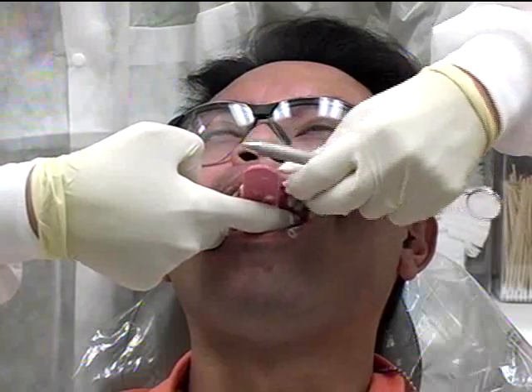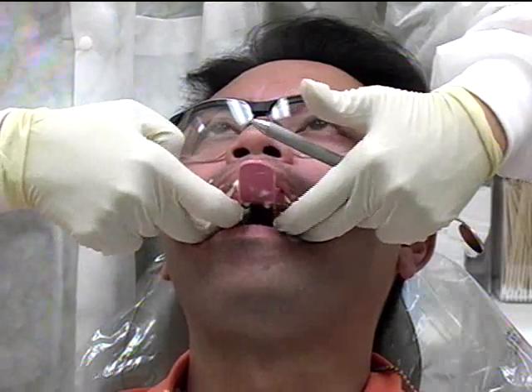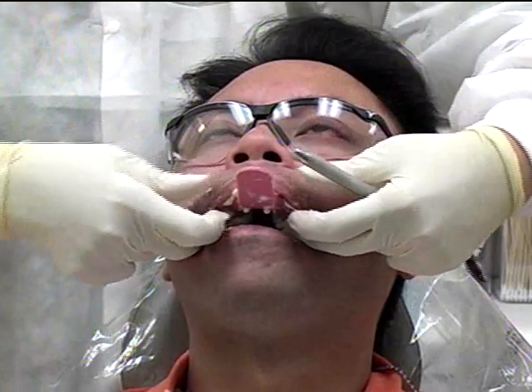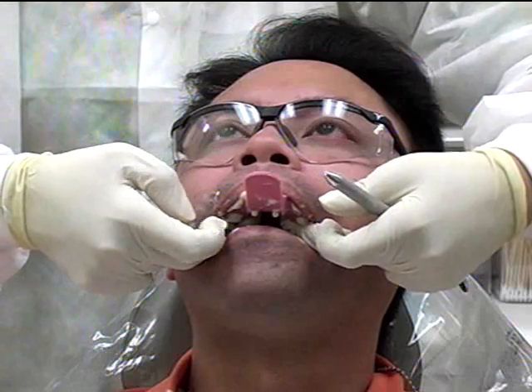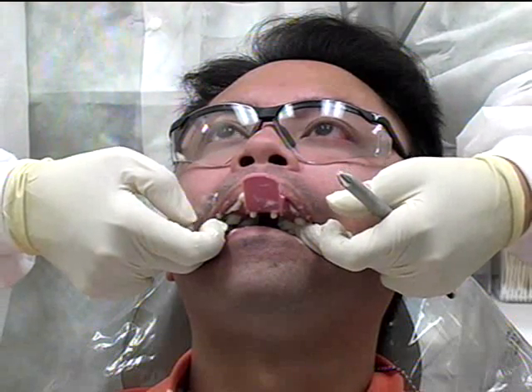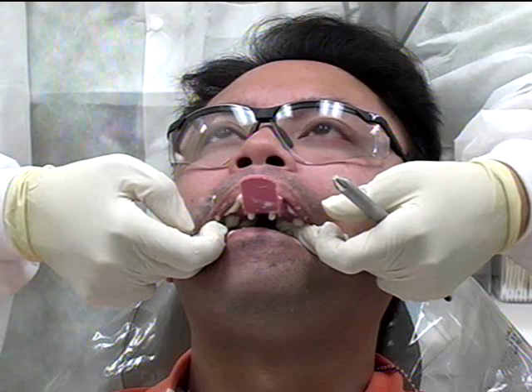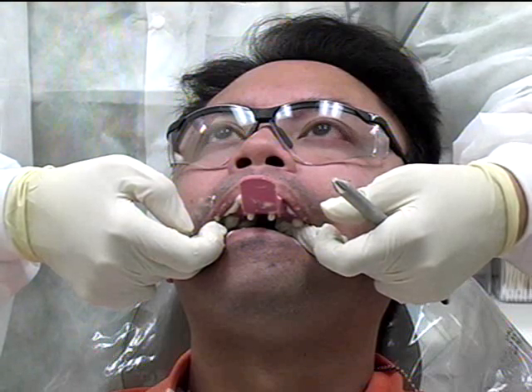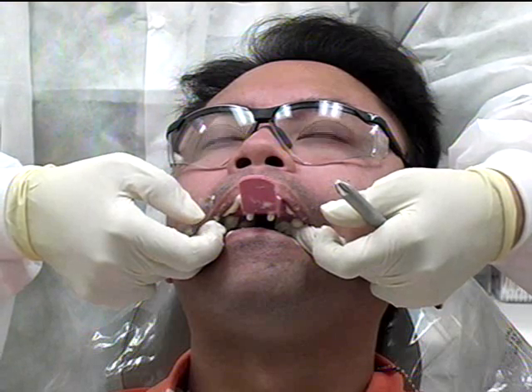Hold the tray with one hand and pull the lip and cheek with the other hand. Switch hands and repeat on the opposite side to allow material to flow into the vestibule, to mold the border, and to free trapped air. Continue passive support until the material sets. Do not leave the patient unattended or the tray unsupported.